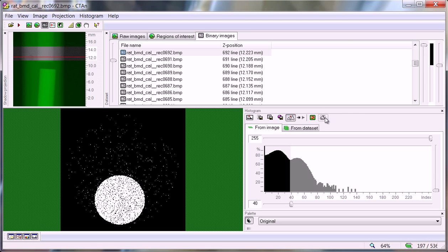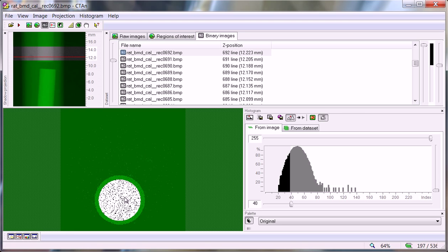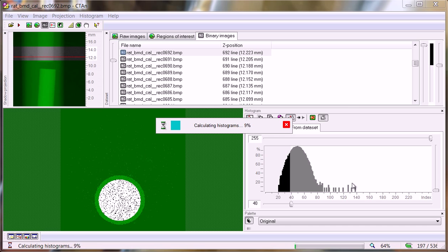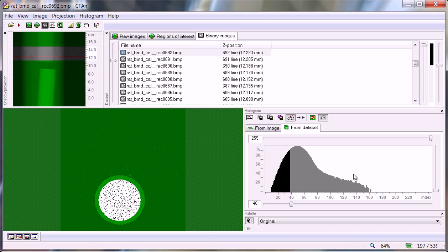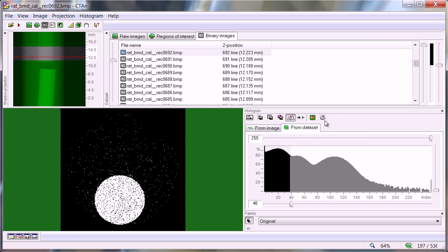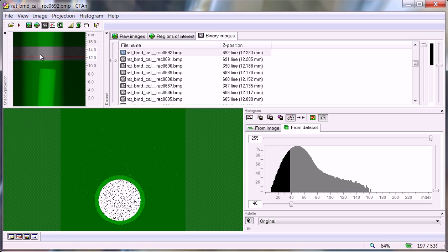We want to click on this button because we only want to know the density within the calibration rod. With the from image tab selected we're only looking at the histogram of the current cross section, number 692. Clicking on from dataset integrates the x-ray density over the entire data set, and the restriction to the region of interest is carried out by this ROI button. Here is the histogram for the whole data set, and here is the histogram from the three-dimensional ROI display.